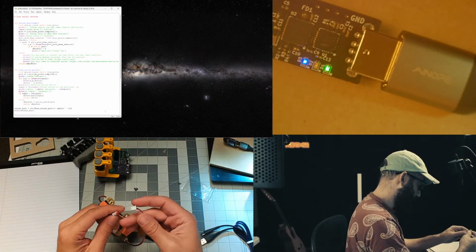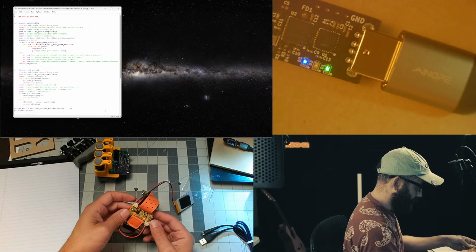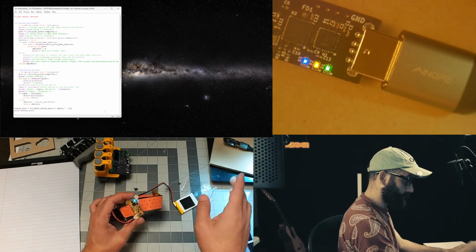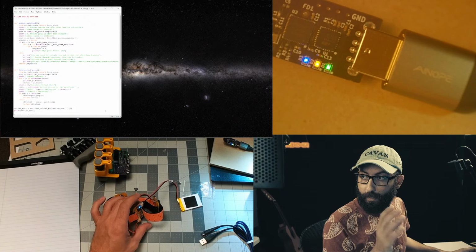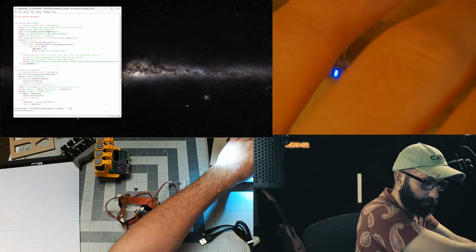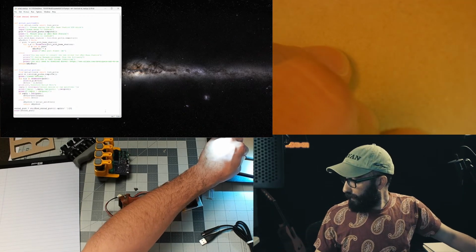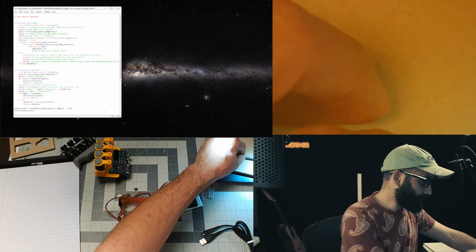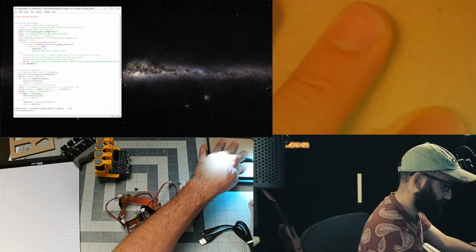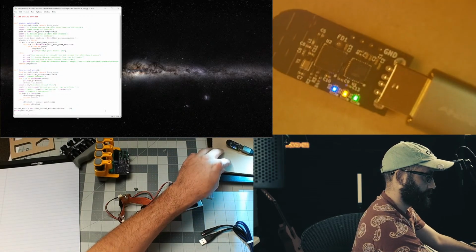So I'm going to plug in one of these uMyos, like so. And I'm just going to turn on this first one. Turns red and it flashes green, and green means that it's in the USB receiver mode, and we do see that the D2 light lights up on the base station. So I'm using the USB base station, and there has got to be an easier way to clamp this. I have clamps. When you need a clamp, well, there we go. That's better.